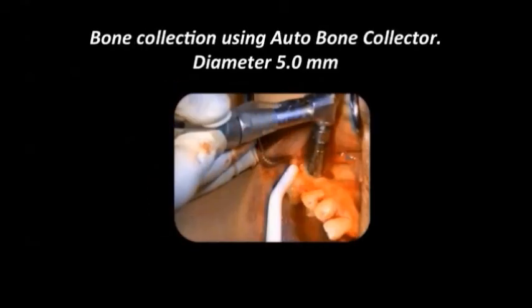Now we use the bone collector that I was discussing earlier, and I use this one of 5 millimeter diameter. I extended my flap a little bit more to the distal side, just to have one single flap, and as you can see, I've noticed that she has a bit of a thick bony bulge. I augmented from that area. You can use this anywhere that you see excess bone, or that you have enough bone in a specific area.